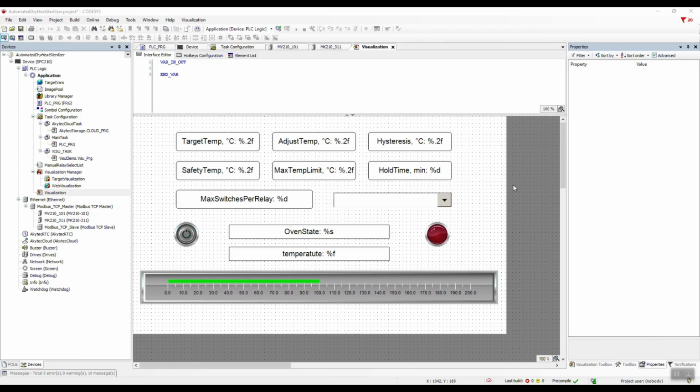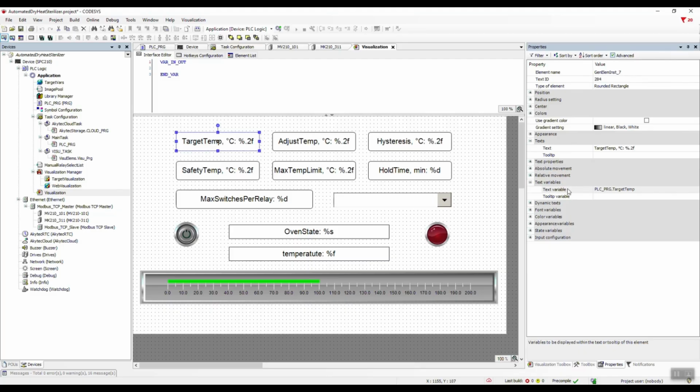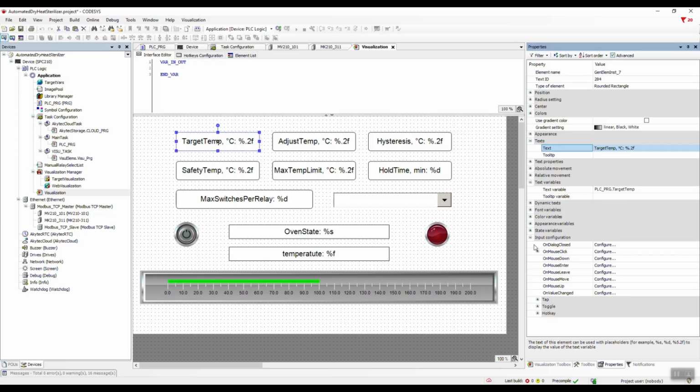Now let's go to the visualization editor and set up the graphical elements. Variables from our program are linked to them through the text variable parameter. In addition, other settings are configured. For example, for elements that display certain values, you need to specify the input-output specifier and, if necessary, an explanatory text. For example, for floating point variables, this kind of specifier is used. Also, for the necessary elements, press handling is configured, for instance, for entering new values and so on. We'll tell you all about this in one of our upcoming videos.